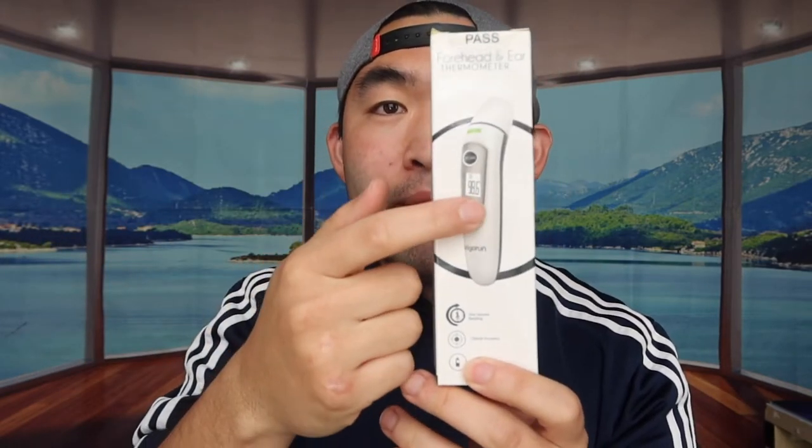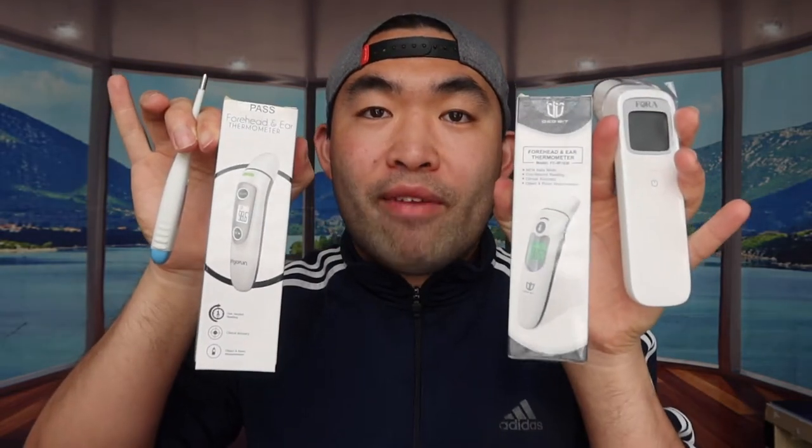This one is the oral thermometer you put inside your mouth. This one right here is the infrared one where you can put it onto your forehead or into your ear. I have another one that works the same way — forehead or ear. And this last one is also infrared but doesn't have the ear option. There are obviously a lot of other options out there in the market as well.